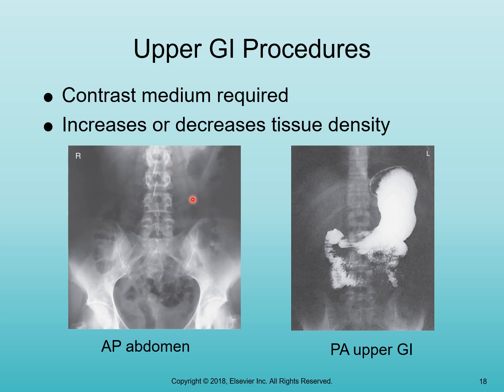We can see the psoas muscles right here. But everything, liver, all of that looks to be about the same mass density, meaning there's not a lot of differentiation in here. That's why, in order to see a hollow organ, you have to put contrast media in there so that it stands out against the other anatomy.